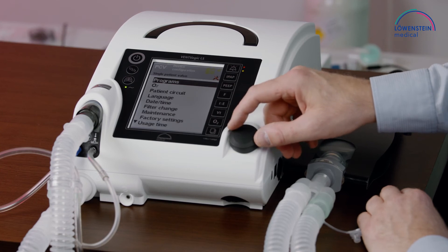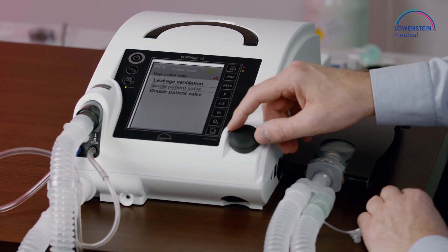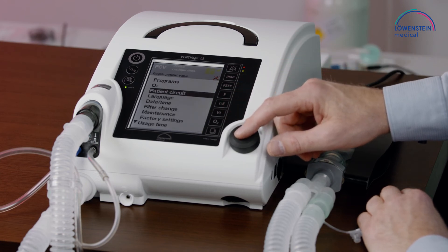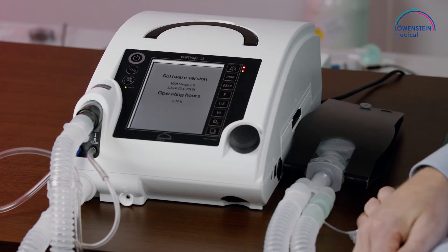Select patient circuit, choose double patient valve, and now we can start the ventilation in double circuit mode.